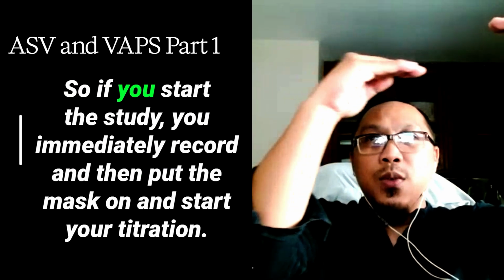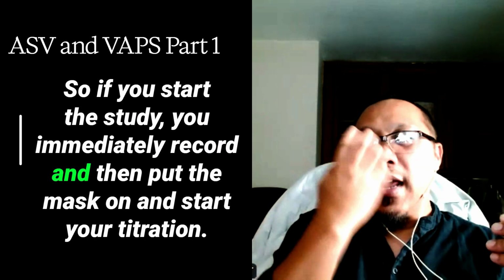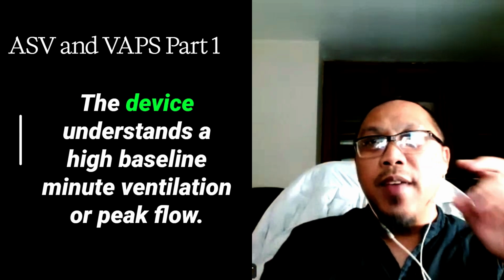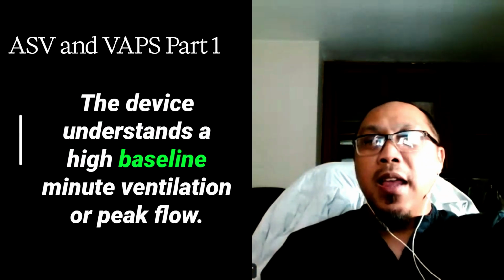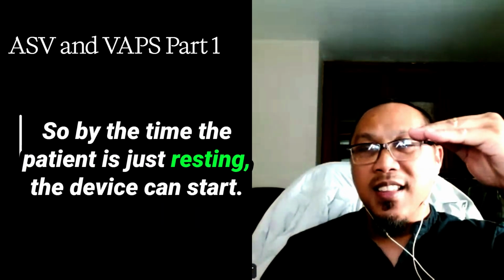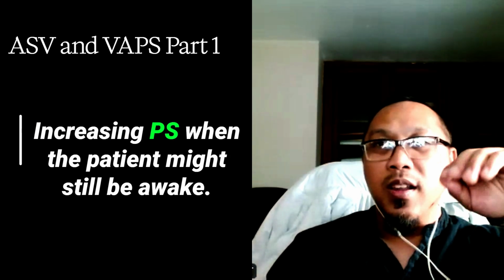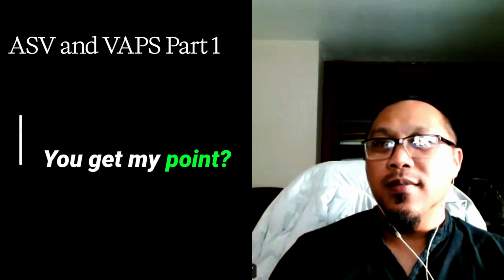So if you start the study, you immediately record and then put the mask on and start your titration. The device understands a high baseline minute ventilation or peak flow. So by the time the patient is just resting, the device can start increasing pressure support when the patient might still be awake. You get my point?